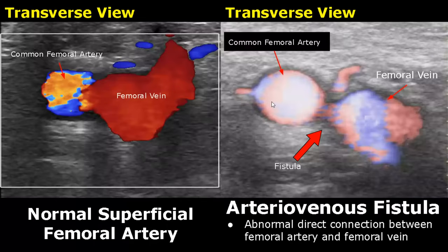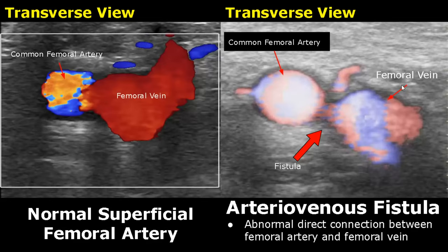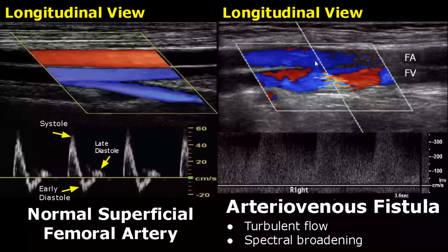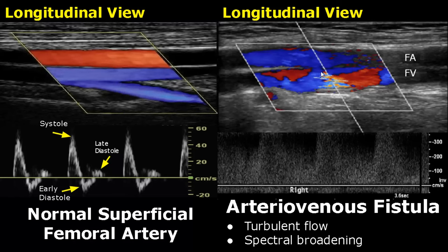An arteriovenous fistula is an abnormal direct connection between the femoral artery and femoral vein. In transverse view with color Doppler applied, we can see this connection between the femoral artery and vein with color mixing in both vessels. Here is an arteriovenous fistula in longitudinal view showing the connection between the artery and vein. We see turbulent flow with spectral broadening.